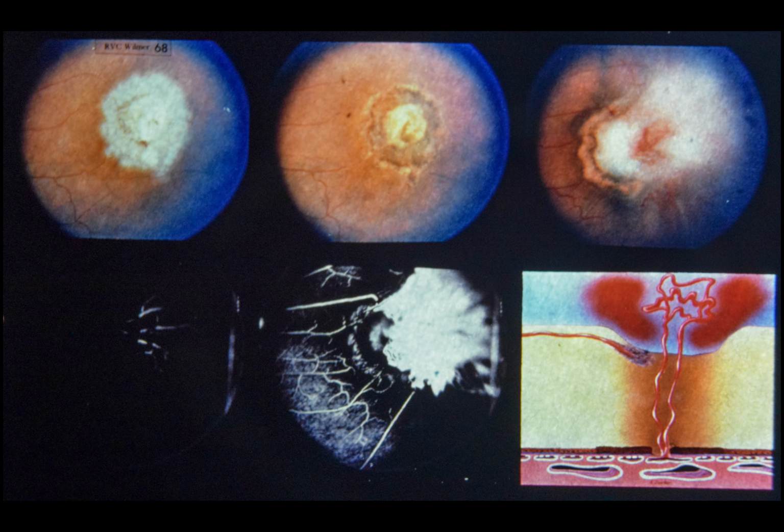This patient has had recurrent vitreous hemorrhages from this choroidal vitreal neovascular membrane, and no therapy has been possible due to inadequate visualization. Fortunately, the retina has remained attached. When the media clear further, an attempt will be made to close this neovascular membrane. Goldberg has reported only moderate success in closing such membranes utilizing cryotherapy, xenon arc photocoagulation, and partial penetrating diathermy.